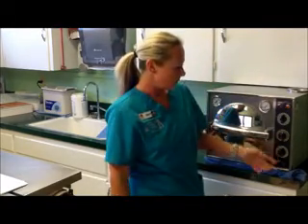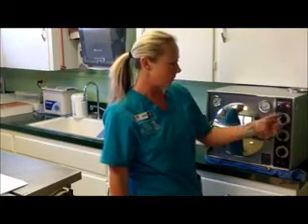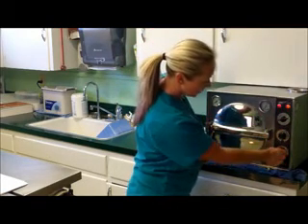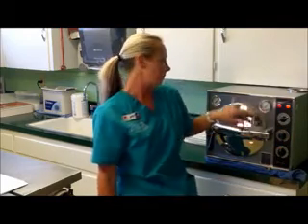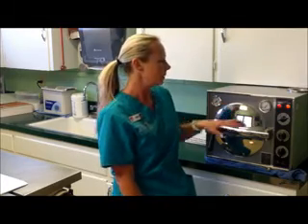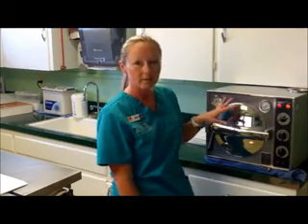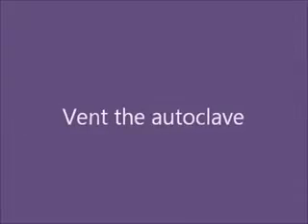Alright, we will turn the knob to sterile, but first we will set the time to about 40 minutes. And put this to sterile, and the pressure is over here. Pressure will be somewhere between 20 and 30 psi. The temperature is usually around the 260, 270 mark. Once this has finished in about 40 minutes, we will come back and open it.